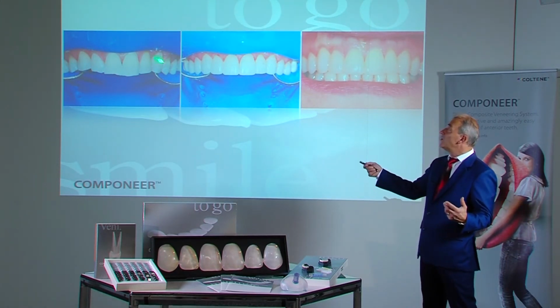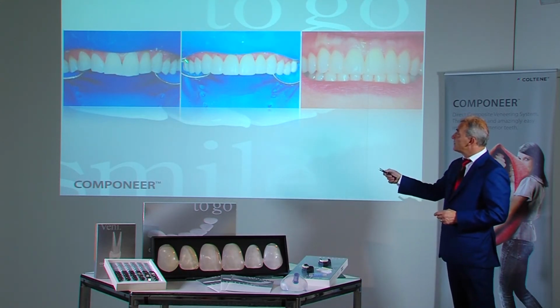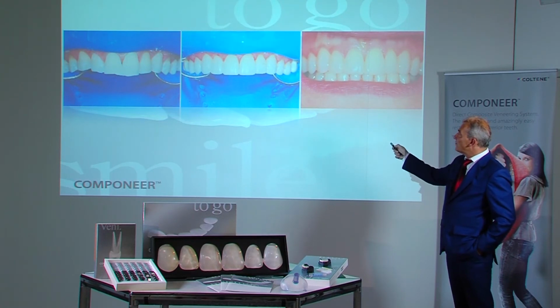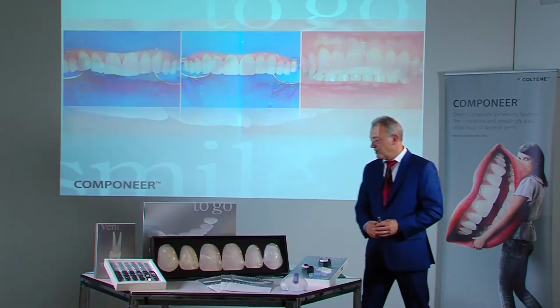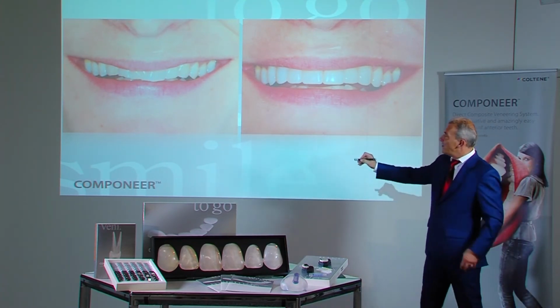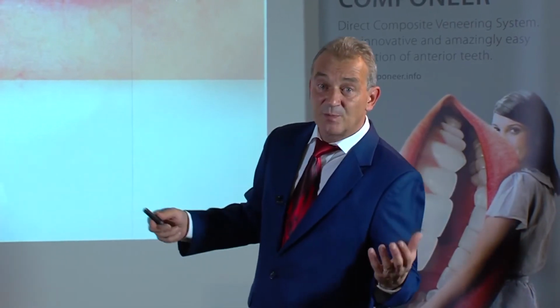The teeth are now conditioned and roughened. And one can see that we've created more space by rounding the dental arch. This alleviates the bad habit of grinding teeth. And in this case, the lip profile is also important. The lips should always be assessed when people speak.